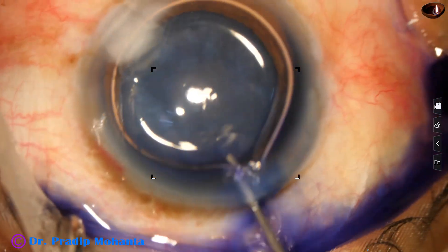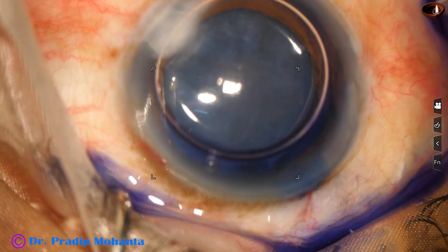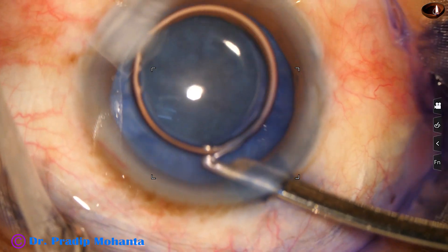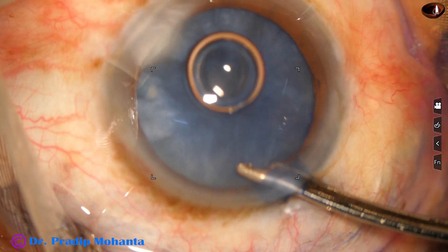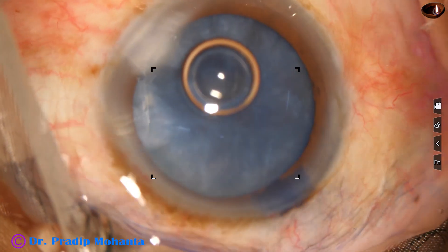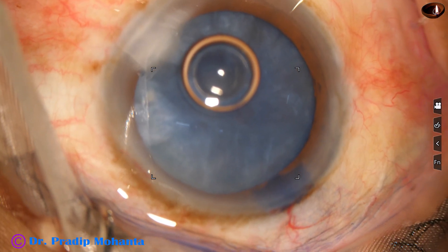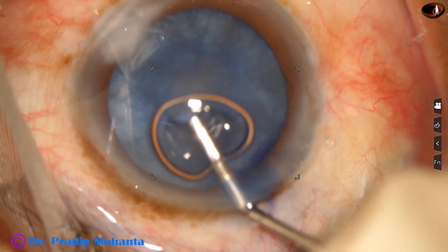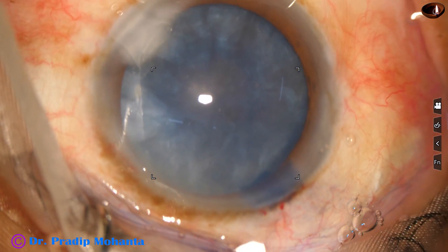This is a bit of adrenaline and now the dye is washed out. This is a 23-gauge Simcoe cannula. The dye is nicely washed out and then 2% hydroxypropylmethylcellulose, that is HPMC, is used as the viscoelastic substance.